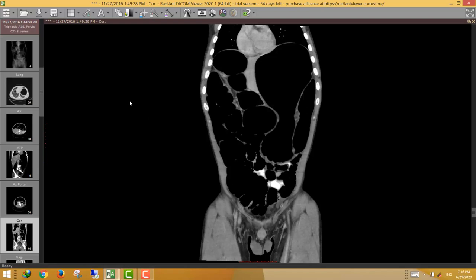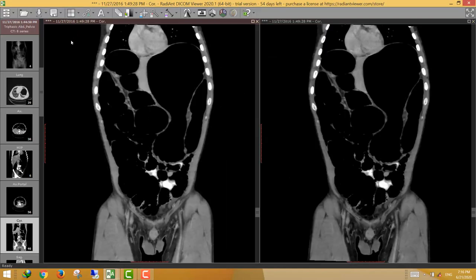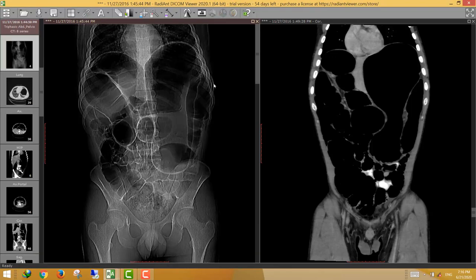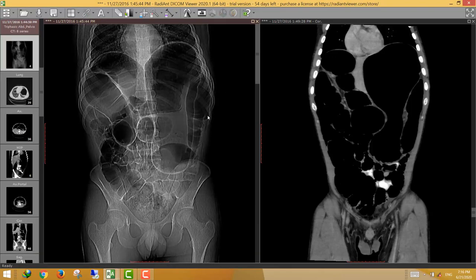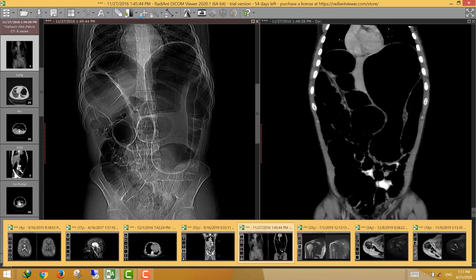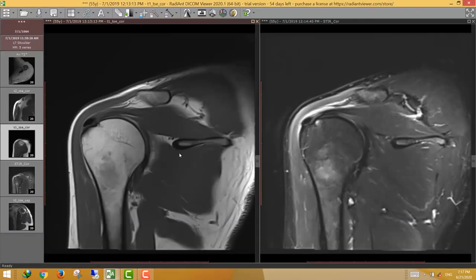This pattern of sigmoid volvulus obstruction is known on X-ray as the coffee bean appearance. On the scanogram, we can see the characteristic dilated sigmoid colon in the coffee bean pattern with internal lines representing adjacent bowel walls. This is a case of sigmoid volvulus with proximal large bowel obstruction.